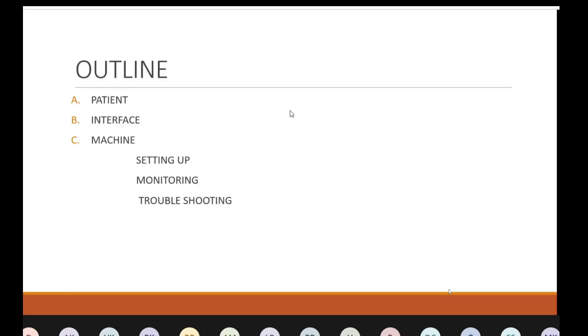So now we have started the patient on NIV, on high FiO2, and on, let's say, a PEEP of 10. How will we monitor this patient? You are looking at the patient. Ideally, when we are taking rounds, we should try to talk to the patient, if it is possible to remove his mask and talk to the patient, see if the patient is comfortable or not.